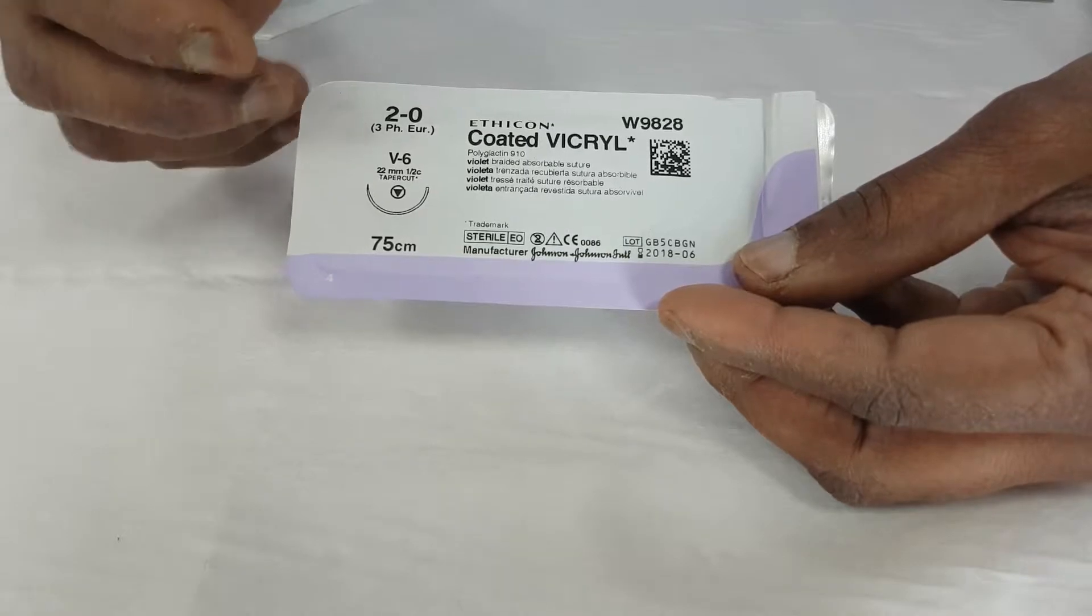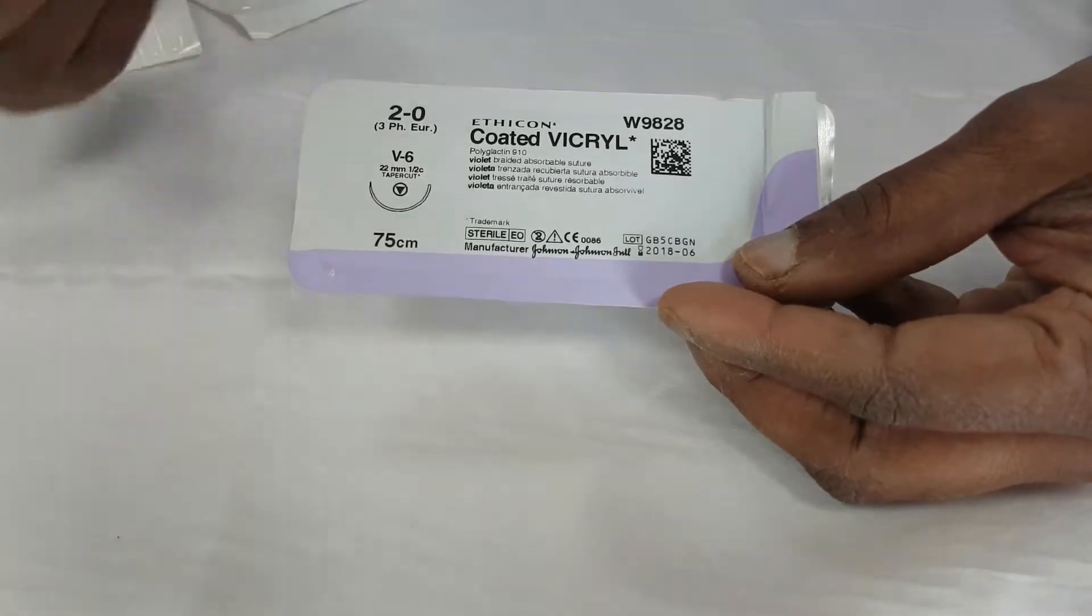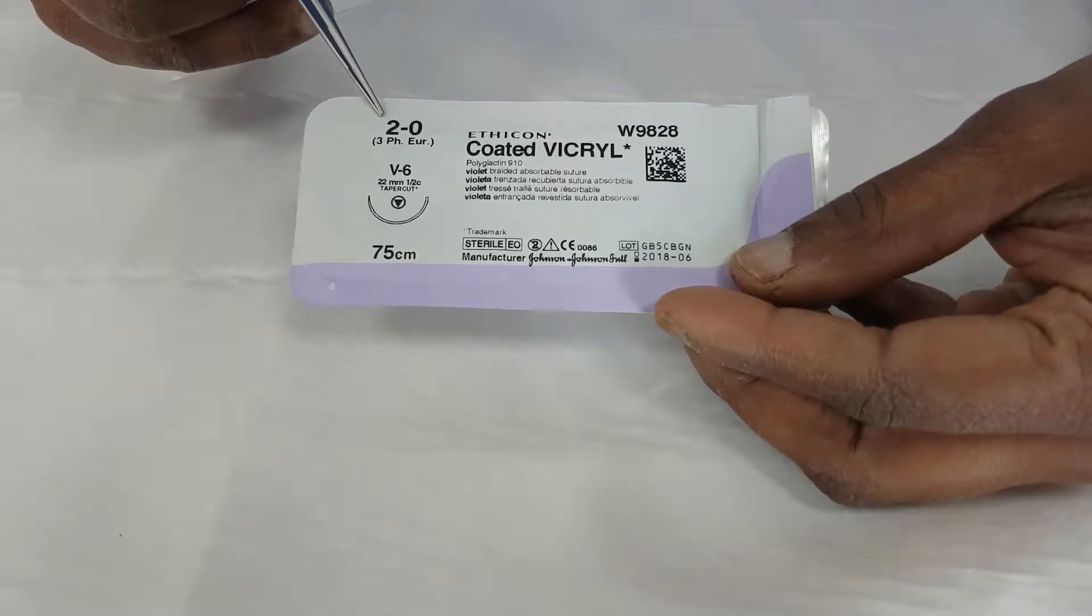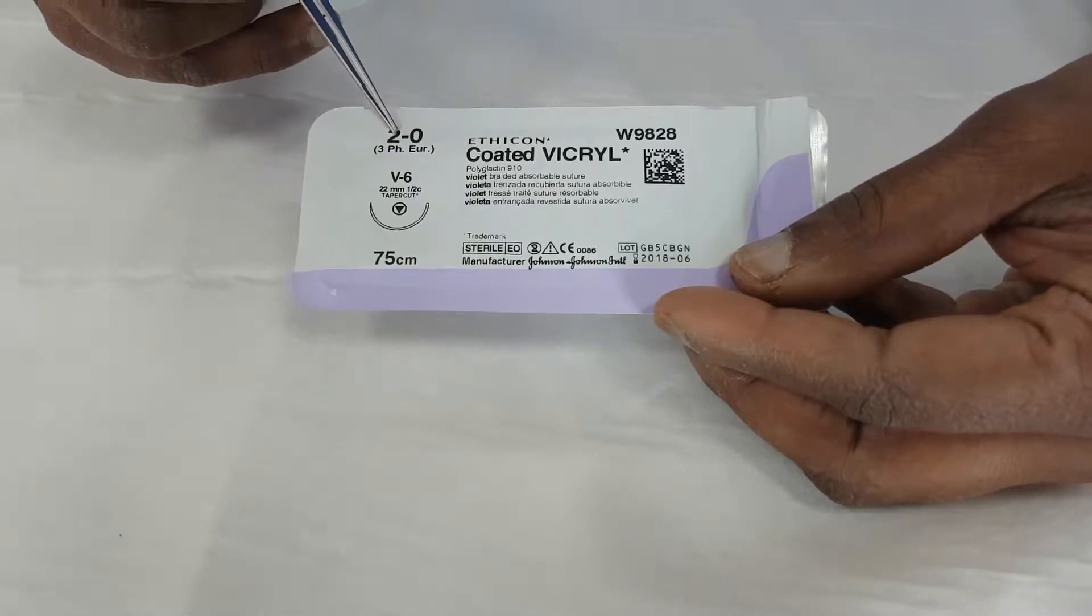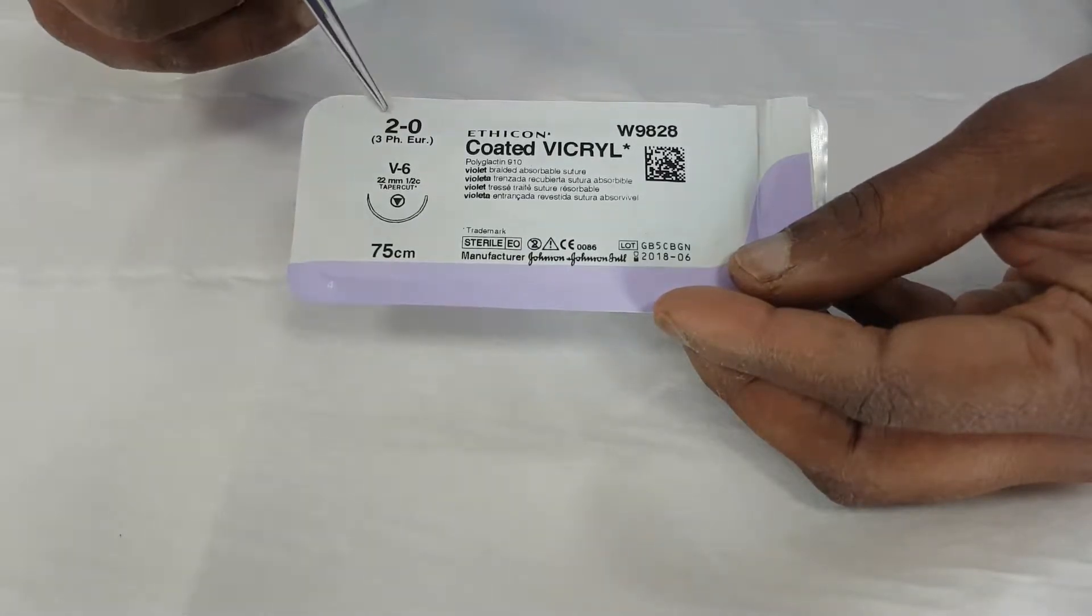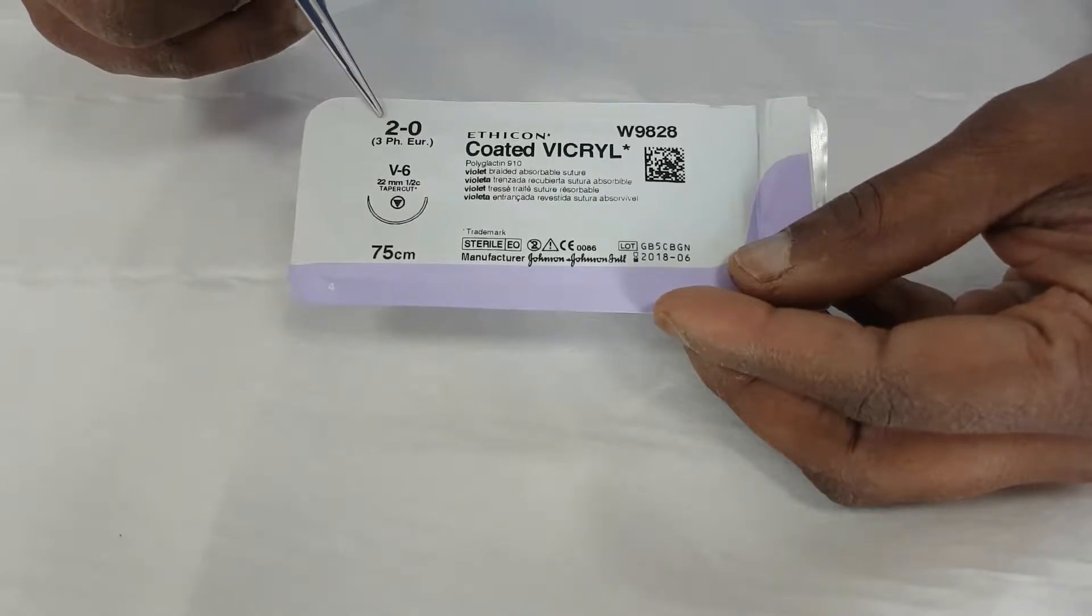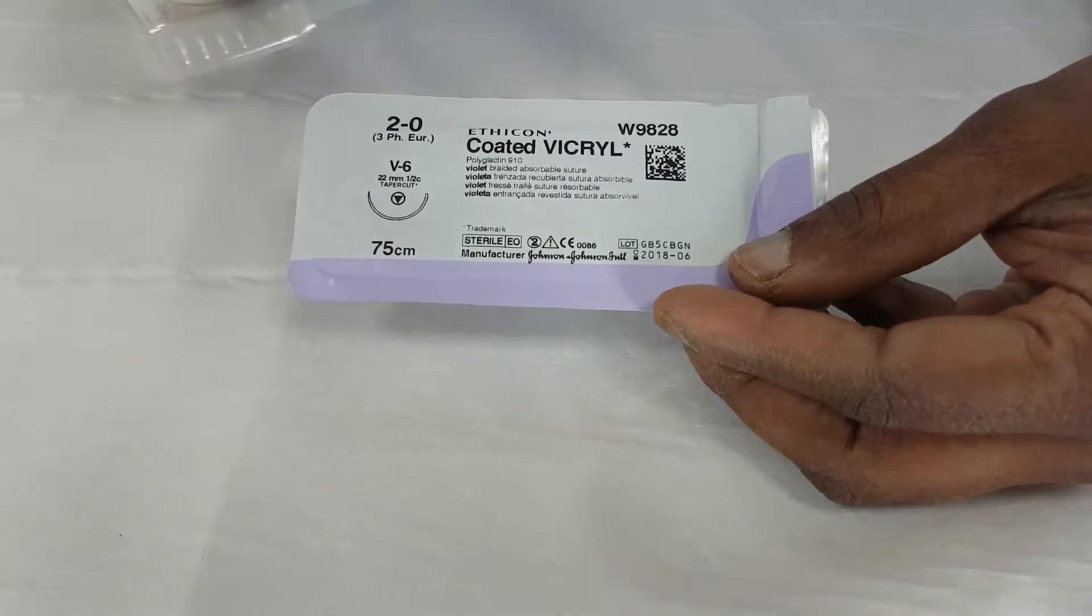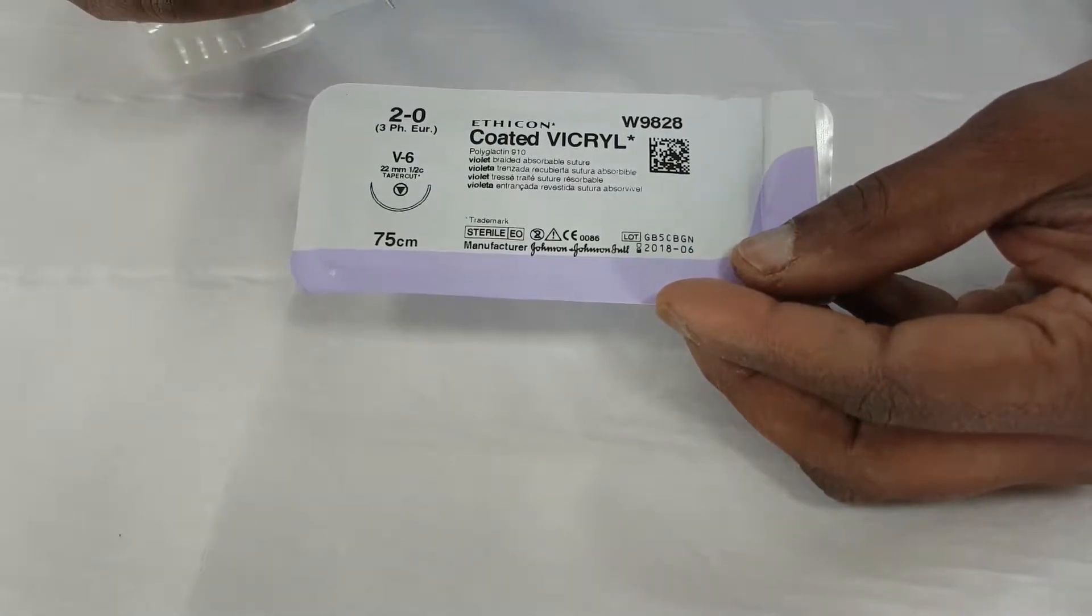When you look at a stitch and pick it up, the first thing to do as well as looking at the material that's used is the size of the stitch. The bigger the number, the smaller the stitch. So a 1-0 would be an even bigger stitch, but an 11-0 would be a very tiny stitch that we might use for microsurgery.